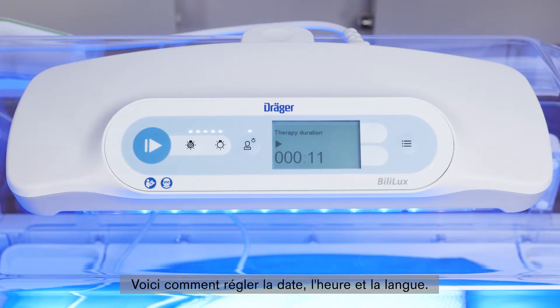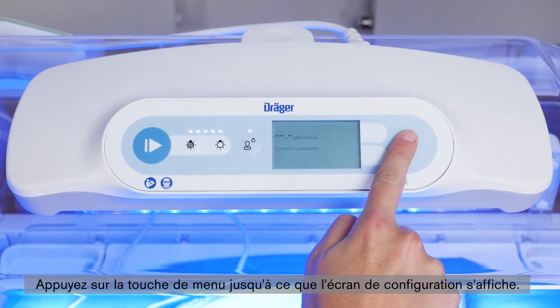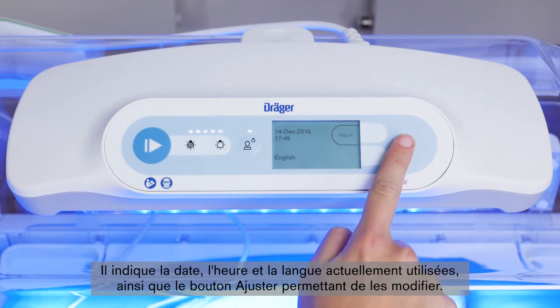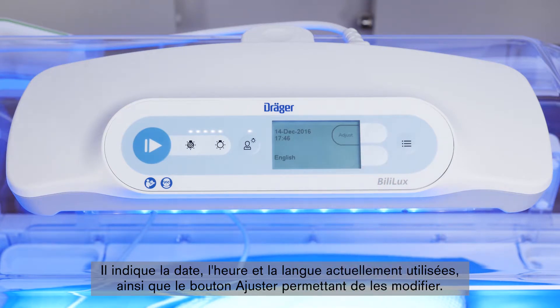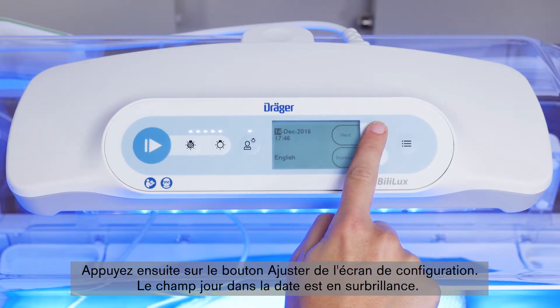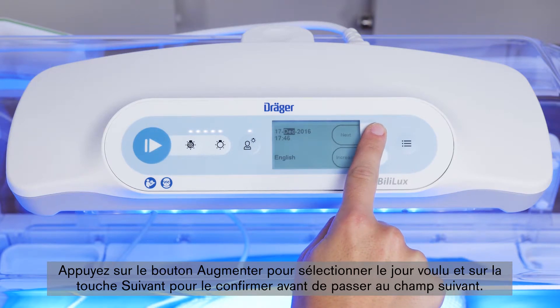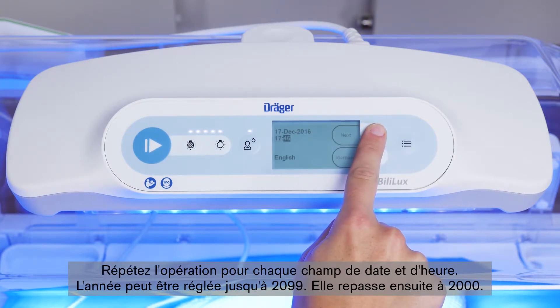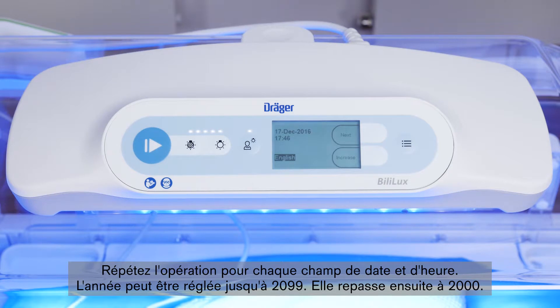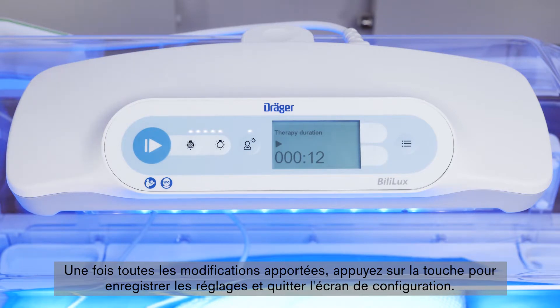Here we show you how to adjust the date, time, and language. Press the menu key until the configuration screen is displayed — it shows the currently set date and time, the language, and the adjust button used to make changes. Press the adjust button, and the day field in the date is highlighted. Press the increase button to adjust the day to the desired setting, then press the next button to confirm and move to the next field. Repeat the process for each field in the date and time. The year can be adjusted until it reaches 2099, then reverts to 2000. When all changes are complete, press the key to save the settings and exit the configuration screen.